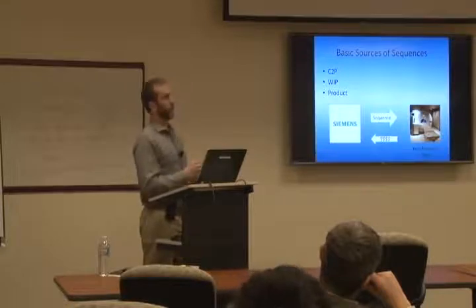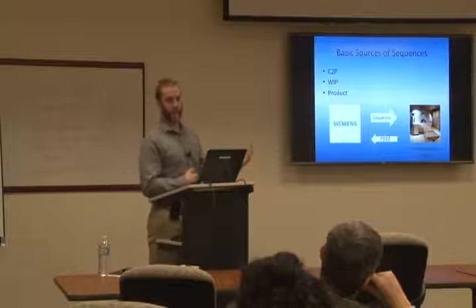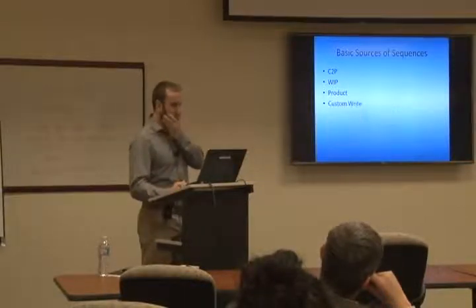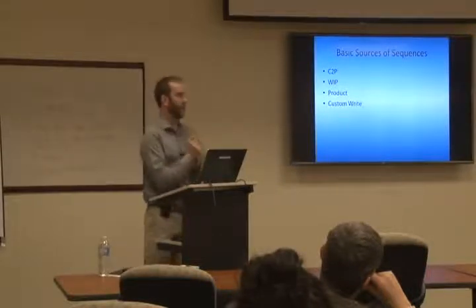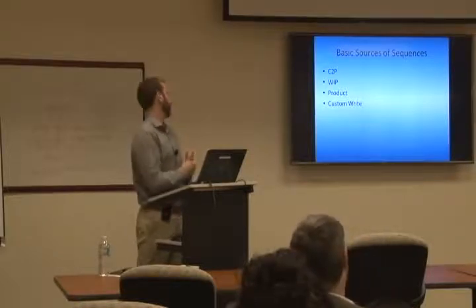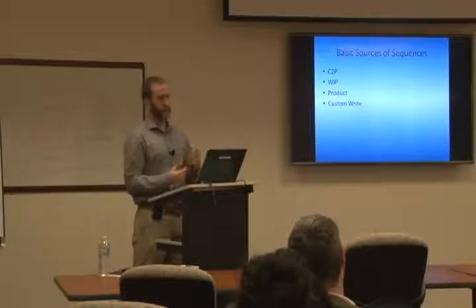One problem is that if you want to go outside that parameter set, you can't do that. Whereas when you have the C2Ps or the WIPs, you probably could. And then the last option is to write it yourself. And this one is more of a project. It can take quite a bit more time. There's a bit of a learning curve when it comes to pulse programming.